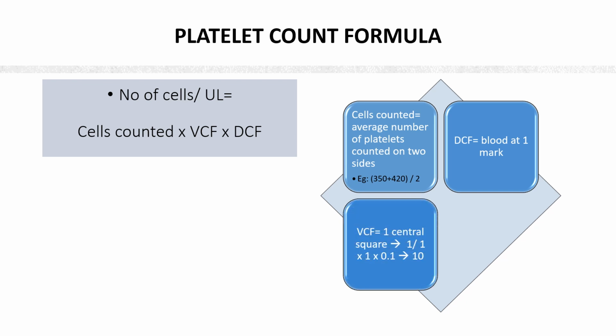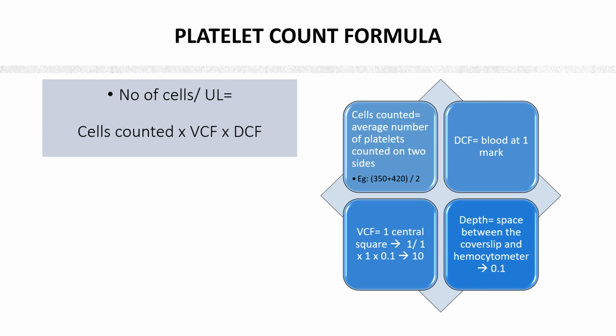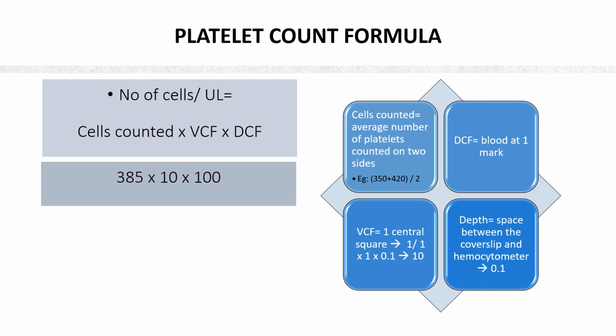VCF is equal to 10, and the depth used is 0.1 in the VCF computation. Our calculation will then be 385 times 10 times 100. Our answer is 385,000 per microliter.